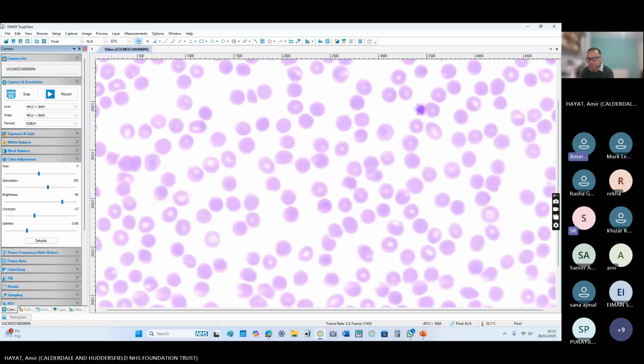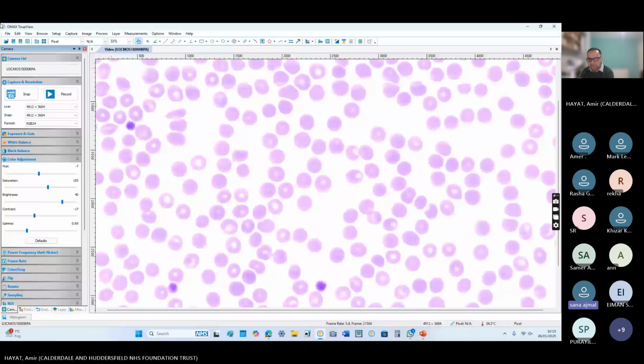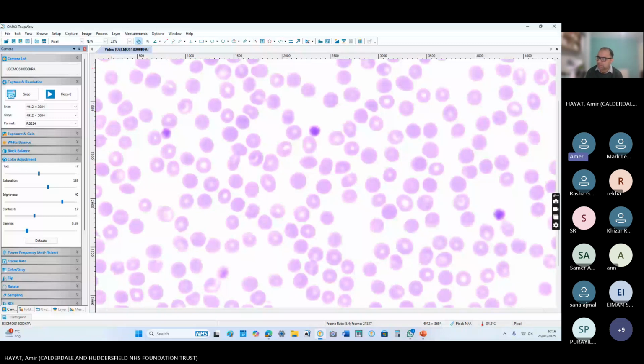Do large-platelet ITP patients come with recurrent bleeding? A few large platelets can be seen with thrombocytopenia, so I would investigate for any inherited platelet disorder as well. With large size platelets, the main ones are Bernard-Soulier and gray platelet syndrome, but these don't look gray on morphology.